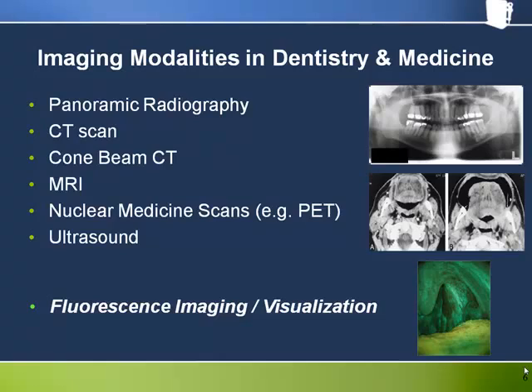These techniques are inevitably part of a larger picture that includes a lot of other information from other sources. Also, they are more useful in some contexts than in others. The value they bring often depends on the particular type of clinical situation in which they are used. Like these other methods, fluorescence visualization with VELscope adds value because it provides visual information that cannot be acquired in any other way: the fluorescence response of normal mucosal tissue to violet-blue excitation light. We'll see in later segments that this is very sensitive to disease processes occurring within the tissue.